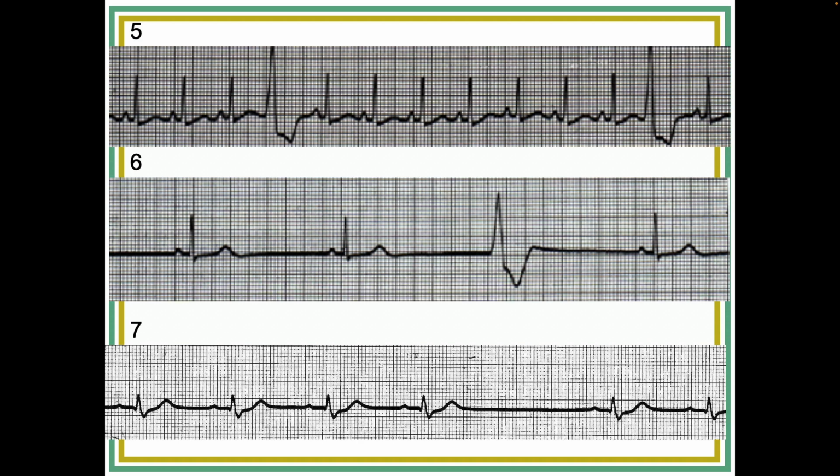Although you're exactly right. So, underlying rhythm, we can call it, you're right on 60, so borderline sinus brady, normal sinus, it's all good. And then, what else? So sinus brady, and then this would be the block, so sinus block. Yeah, good. So again, we're in the exact same situation as the one Chris did, where it's not an escape beat because it just picks up again, pretty much exactly the same. So it's just some kind of sinus block or sinus pause.